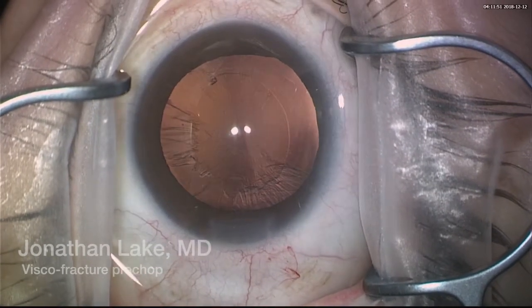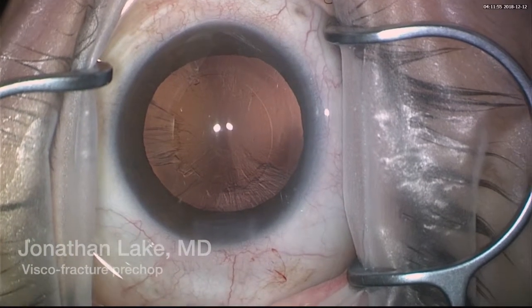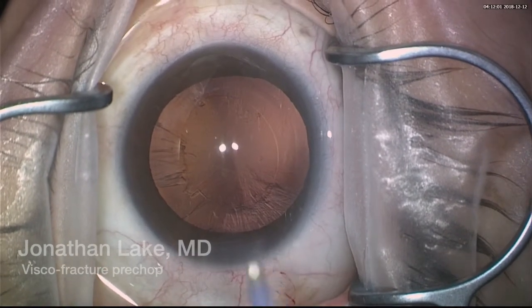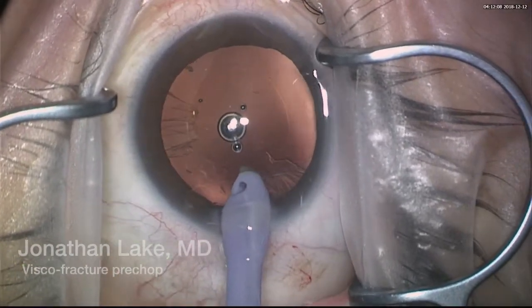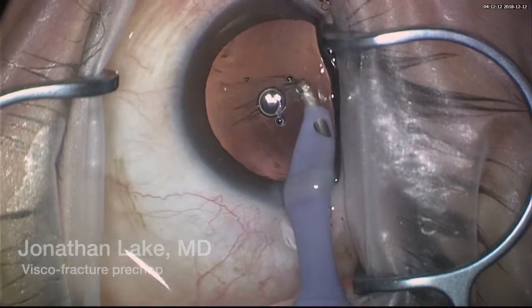I'll just leave the cortex that's under the incision to be aspirated with an irrigation-aspiration cannula. I'm using an irrigation-aspiration cannula from Zico — I think it has a very good angle for aspirating underneath the incision; it's a 45-degree angle.